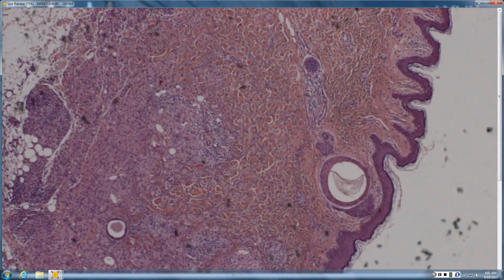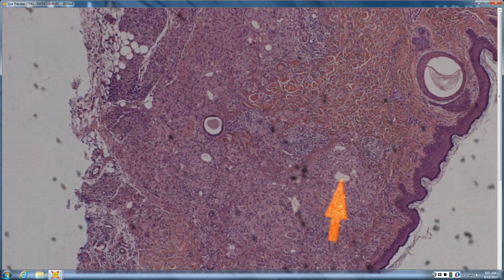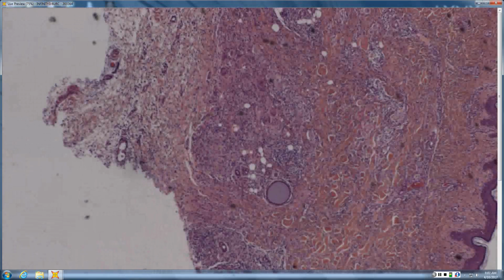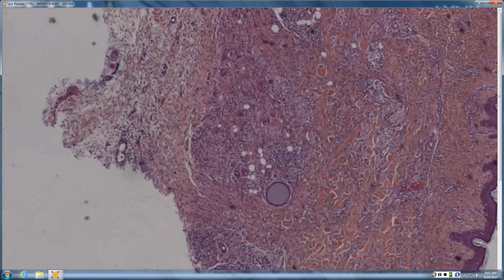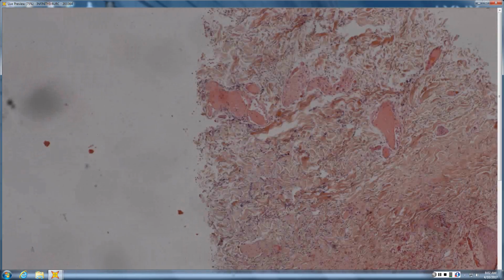So you've got a lot of multinucleate cells. Anything in them? Looks like there's keratin. It's probably just keratin going on. I mean, that's really what it looks like, multinucleate, randomly distributed nuclei, so like foreign body giant cells. And ruptured cyst is what they're saying, which makes sense. Giant cells and keratin.